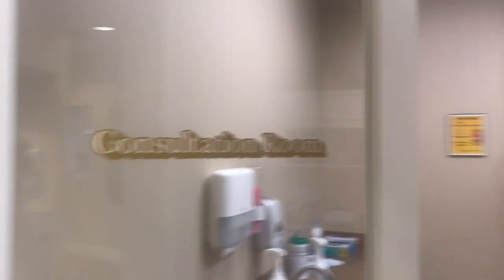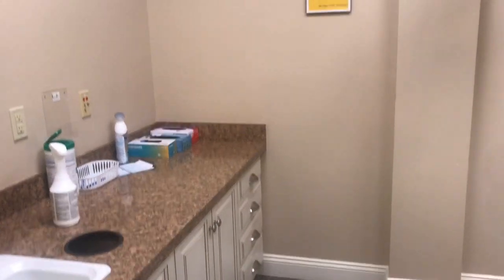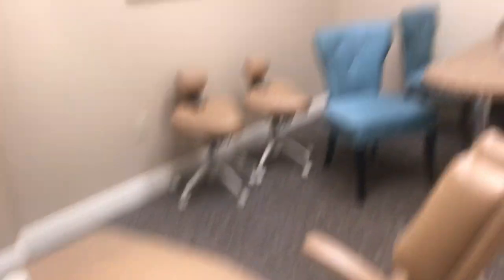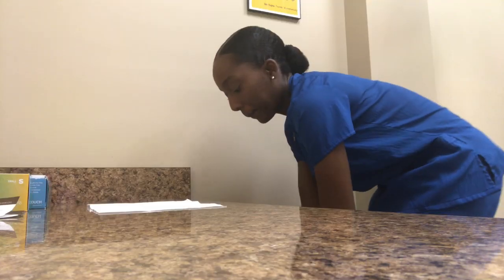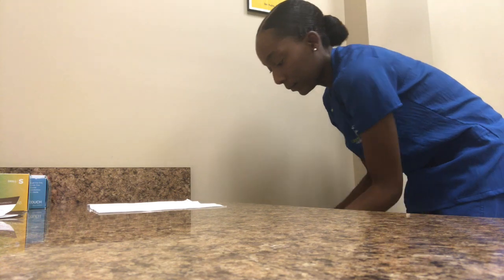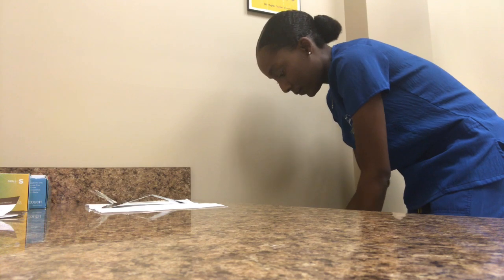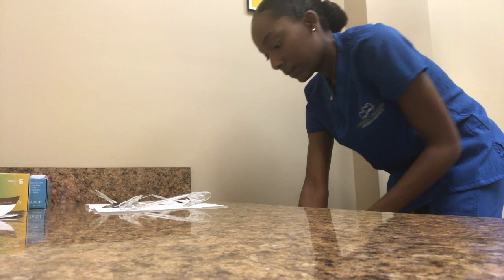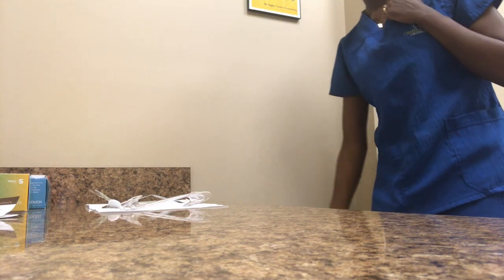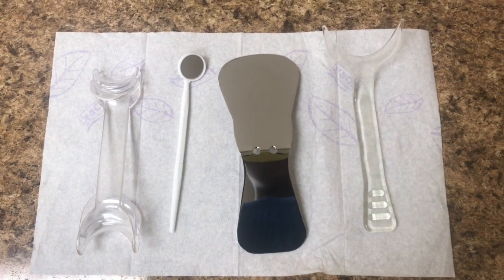Your initial first visit would most likely be a consultation and a records appointment. Here in this room we'll do records. I'm going to show you guys how we set up for our record and consultation visits. Right now I'm just getting out all of the things I would need for this appointment. Here's everything that I will be using.